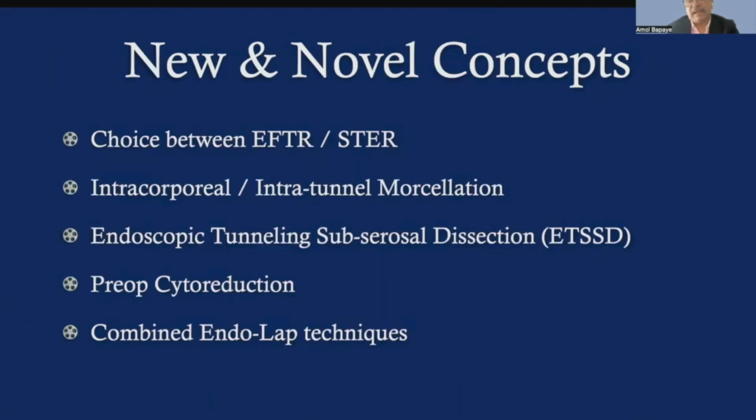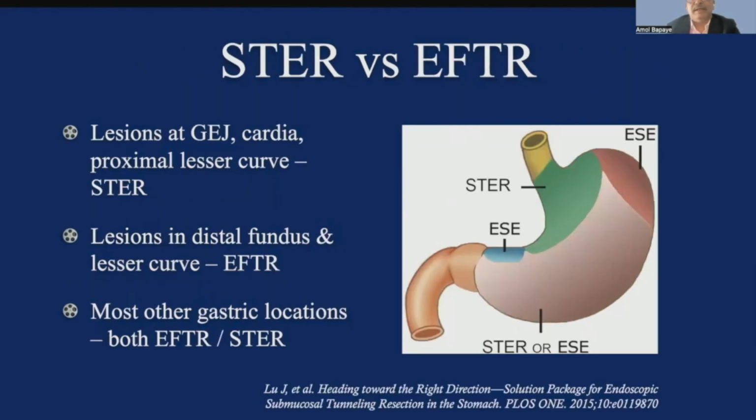Some new concepts have evolved in the last few years. We need to choose between EFTR and STER, and we have to discuss morcellation and also some other techniques. Depending on the location of the lesion in the upper GI tract, we may have to choose between STER and EFTR based on this picture over here. There are some areas which are more suitable for STER as compared to others which are more suitable for EFTR.